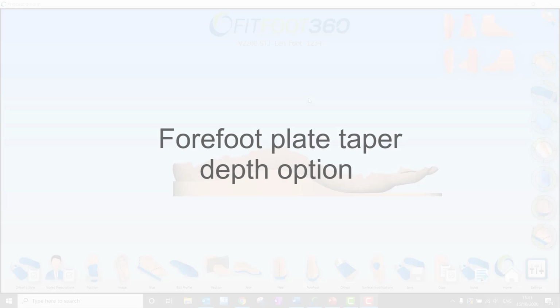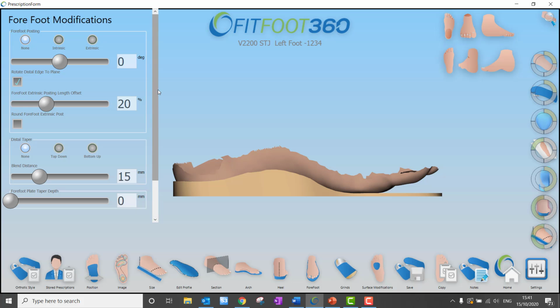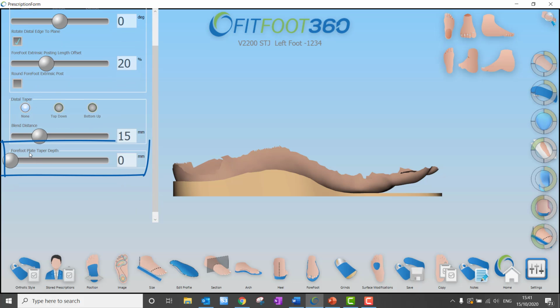In FitFoot360 version 3, there is a brand new forefoot plate taper. At the bottom of the forefoot menu, you will find an option called forefoot plate taper depth. If I increase this slider, you can see the depth of that forefoot or distal area of the orthotic moving away from the scan or the toes. And you can see the increased space there.